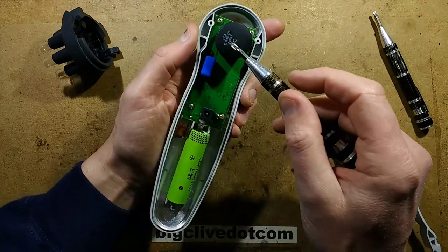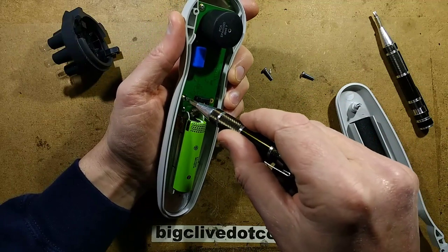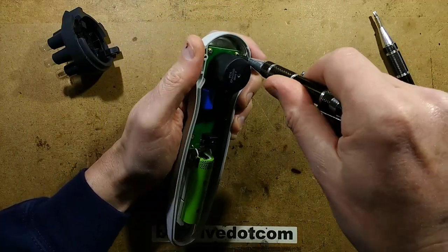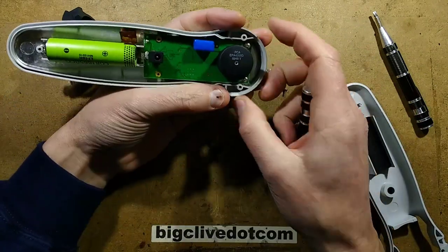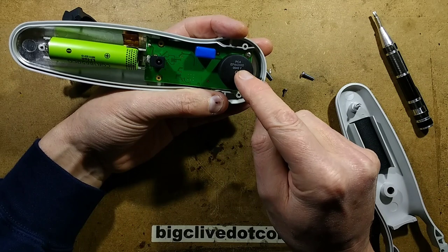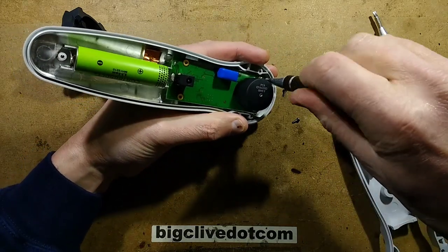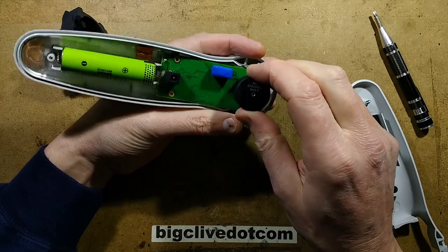I'm seeing a capacitor here and the coil. I'm guessing the capacitor might be part of a resonance circuit, or it might just be charging the capacitor up and then dumping it through the coil. This is quite an interesting thing - I'll have to look that up. PCA EPA4205D0948Y - it looks like a standard high voltage transformer. I wonder what its application is. The battery is glued in, that's a bit annoying.